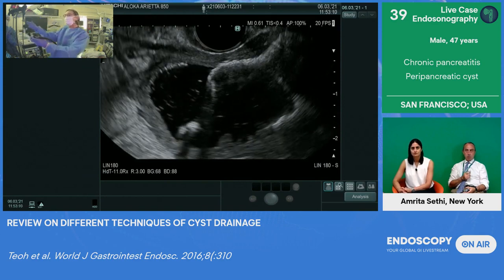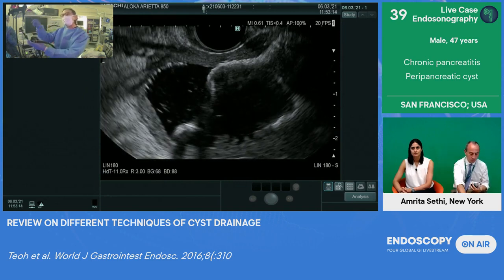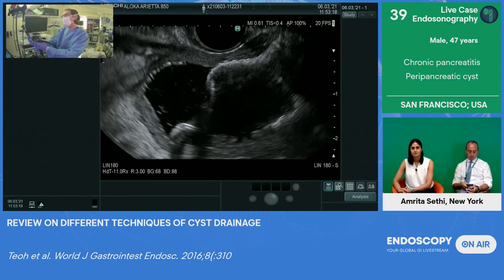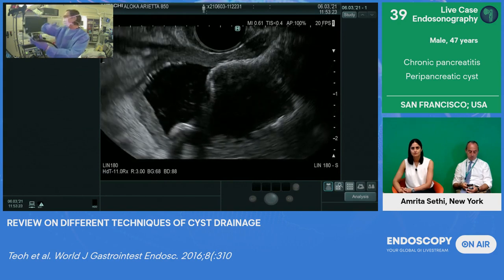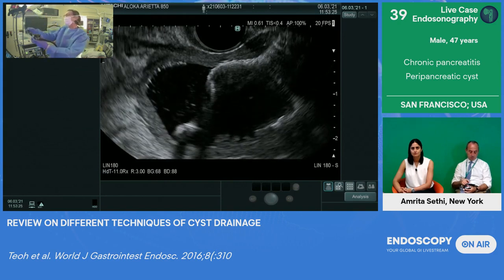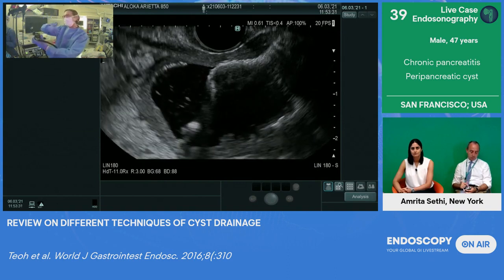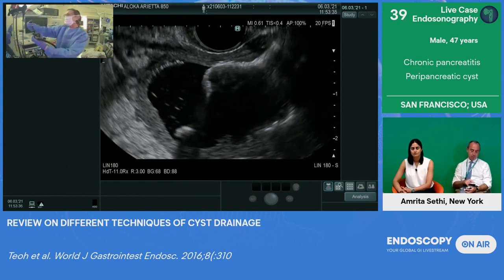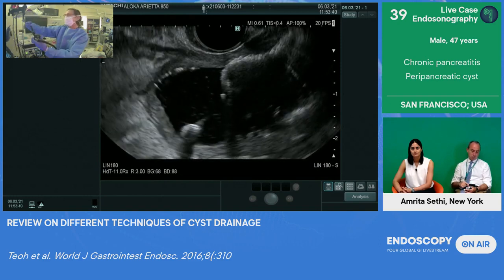All right, so now I'm in great position, and I'm going to deploy the proximal flange inside the working channel of the echoendoscope. So now I'm locking again, right, so that the sheath doesn't accidentally jump forward or anything like that. And now I'm pulling back the gray hub. I heard an audible click, right? So that means that the distal flange is fully deployed. Now I'm just deploying the proximal flange, and it's fully deployed now.